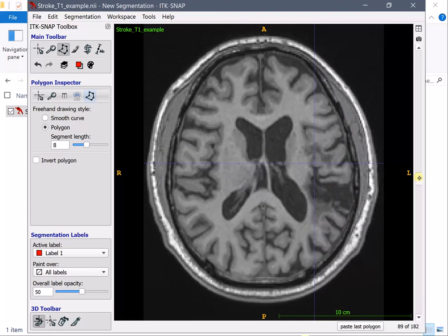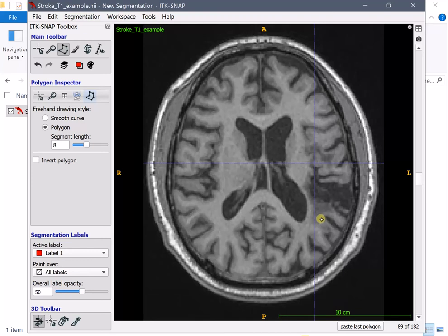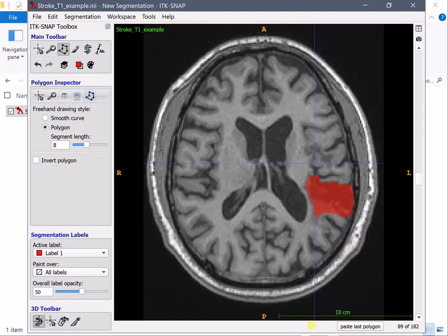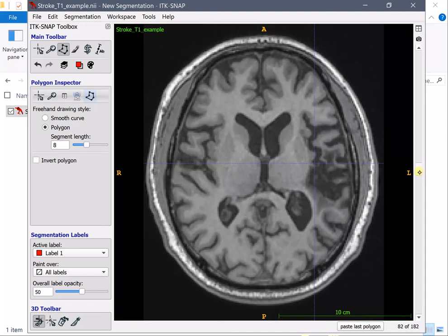So I'm going here at another slice further in there and I'm going to draw another area of the lesion. Very good. And here another one.